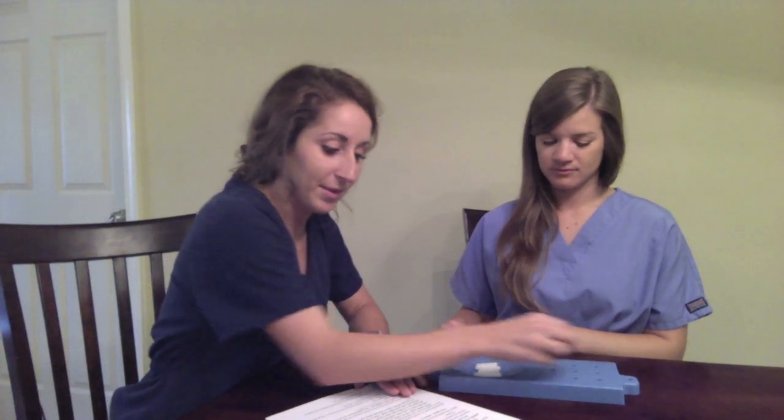Now, I will read the instructions and demonstrate the test to you. Are you ready? Pick up the PEGs, one at a time, using your right hand only, and put them into the holes in any order until the holes are all filled. Then remove the PEGs, one at a time, and return them to the container. Stabilize the PEG board with your left hand. This is a practice test. See how fast you can put all the PEGs in and take them out again. Are you ready? Yes. Go!